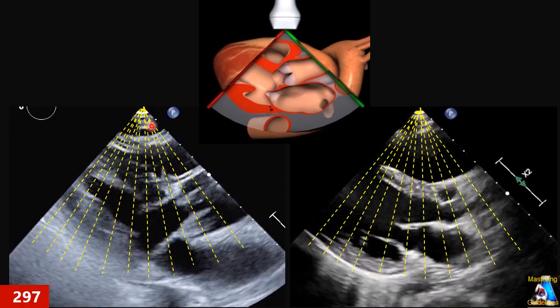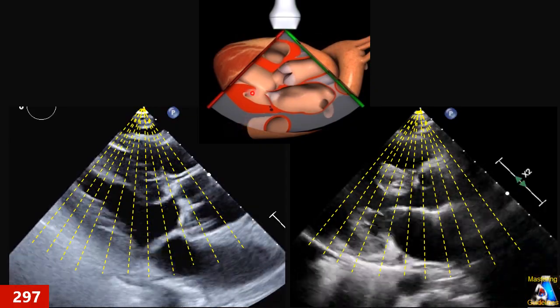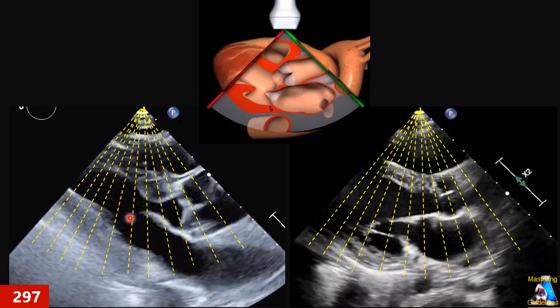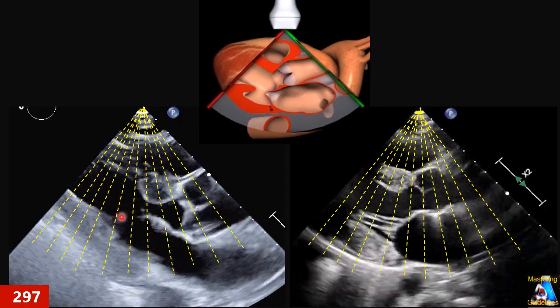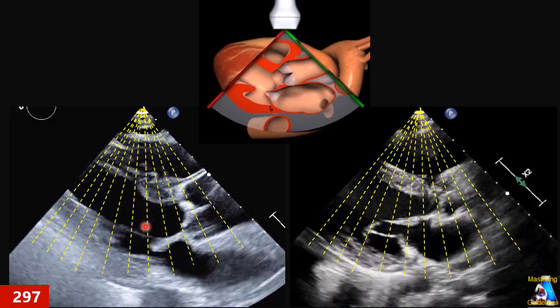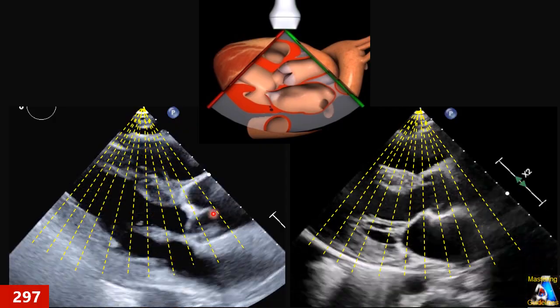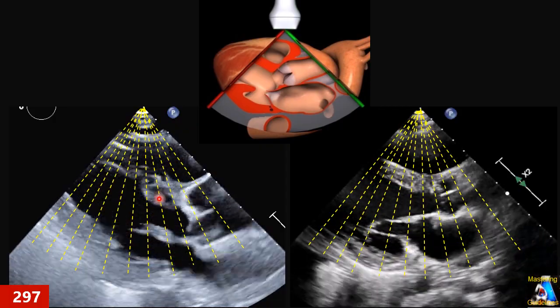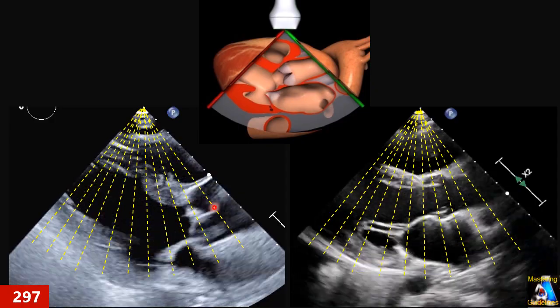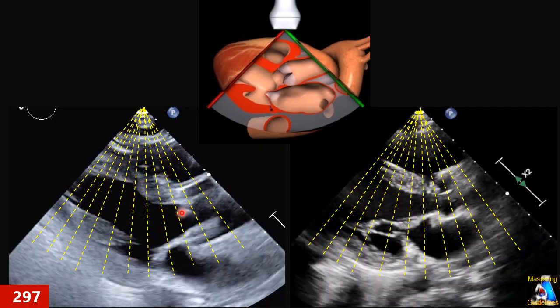If we cannot fix it by moving a little toward the aorta and bringing it to the center, that will be perfect as long as your image is not off axis, meaning the basal third is a rectangle and the coaptation is at the center. That will be completely fine and is not a problem as long as you did your best and couldn't get a window.